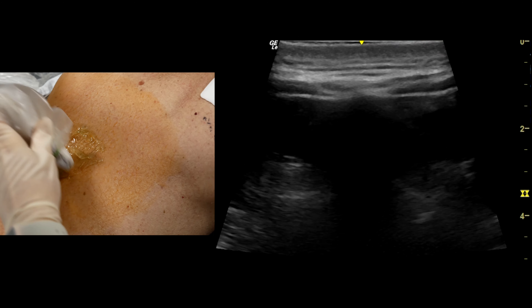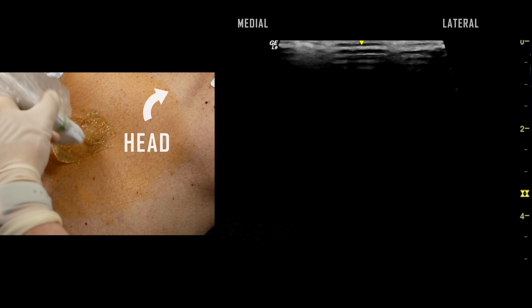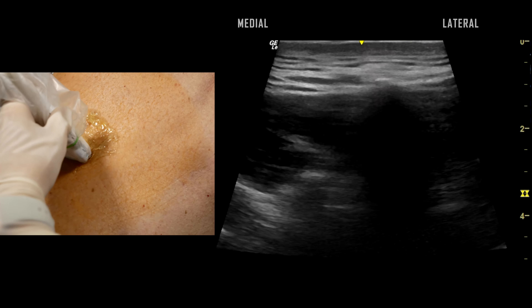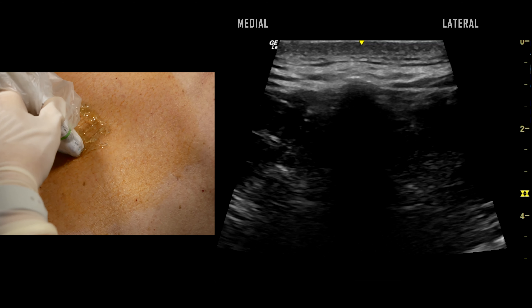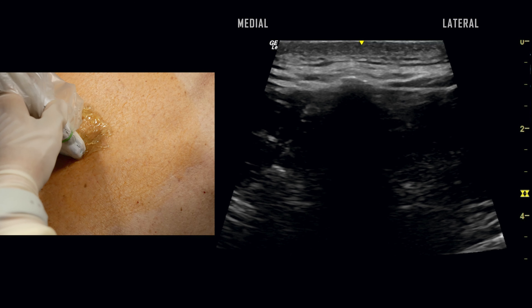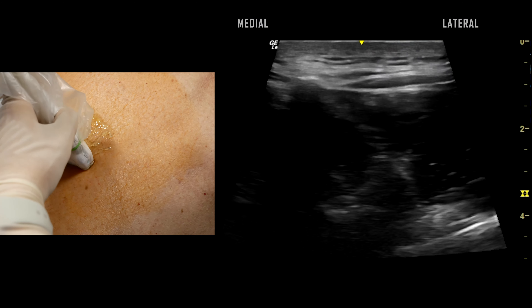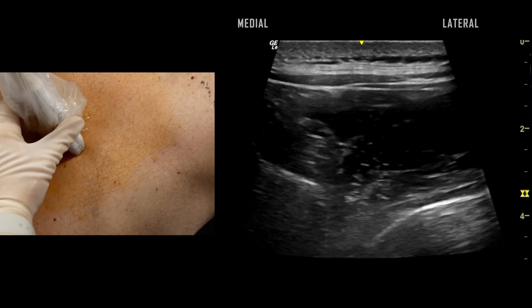The patient is positioned prone for a right-sided thoracic paravertebral block. The transducer is oriented transverse at midline. The spinous process can be seen here as a hyperechoic reflection with a dark acoustic shadow obscuring the underlying structures. With identification of the right transverse process, the transducer is translated laterally to position the transverse process at the lower left corner of the ultrasound image.